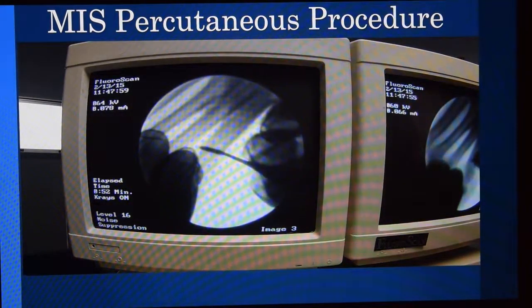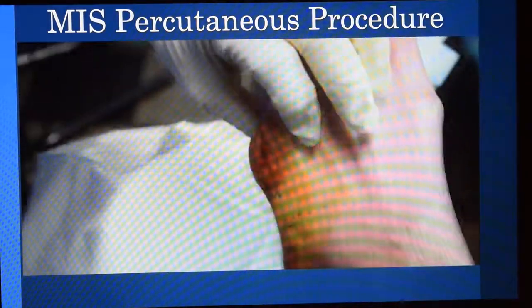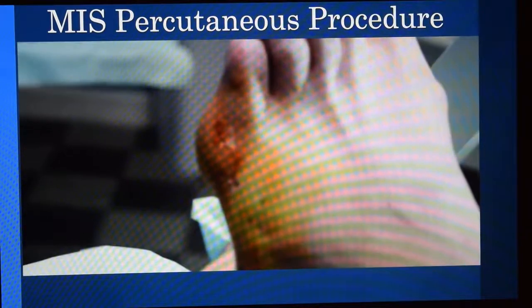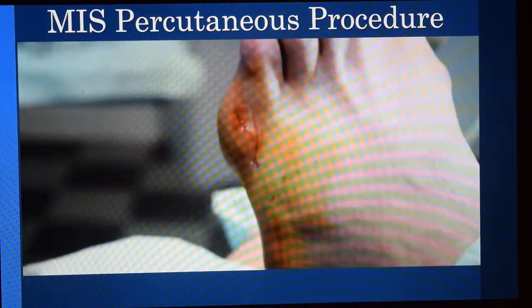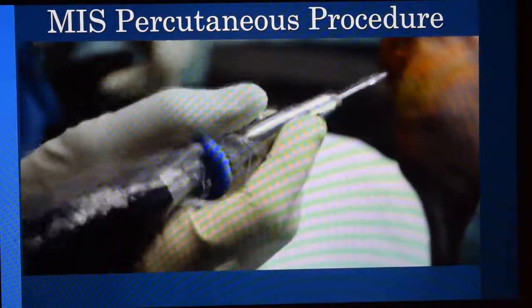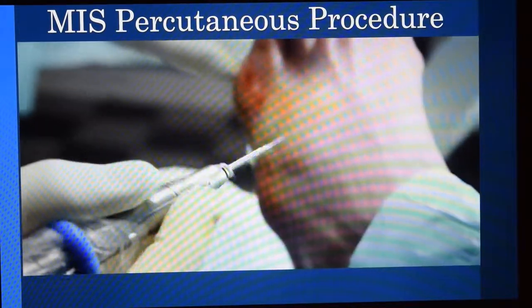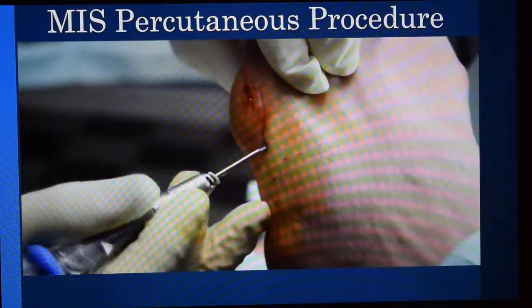Once you know you have a good path for your burr, the burr is then inserted. At this point, in some patients, you go ahead and do the exostectomy. On this patient, who has a plantar lesion ulcer, we're just basically elevating the metatarsal here and shifting over just a slight bit. Now we use either a short Isham burr. In this case, this guy has a little bit bigger bone, so we're going to do a regular Isham burr, or a Shannon will work as well.